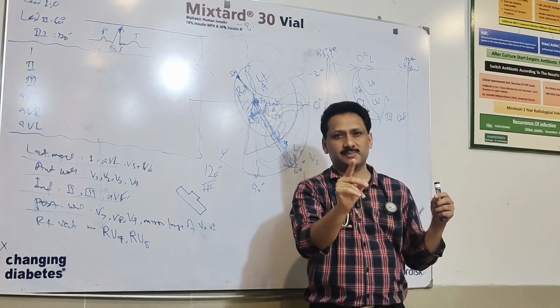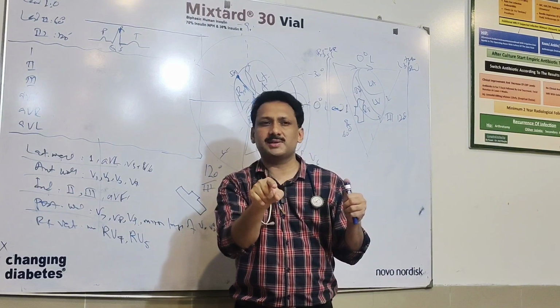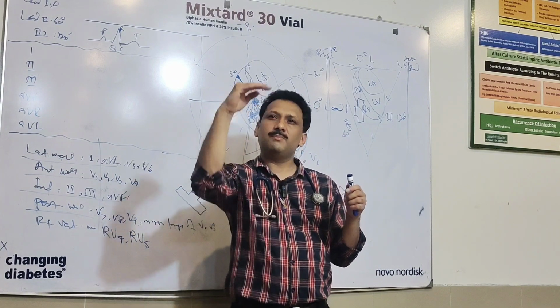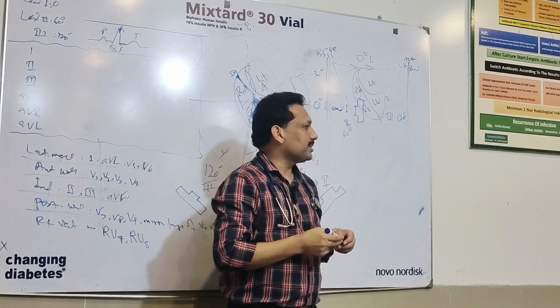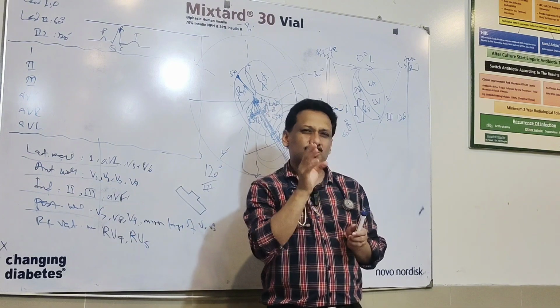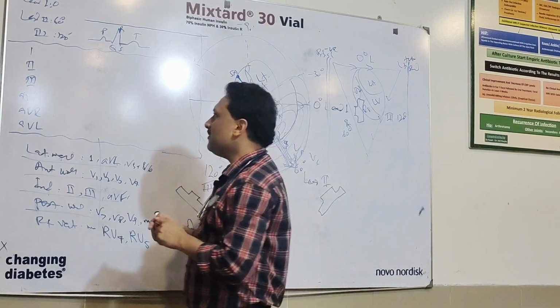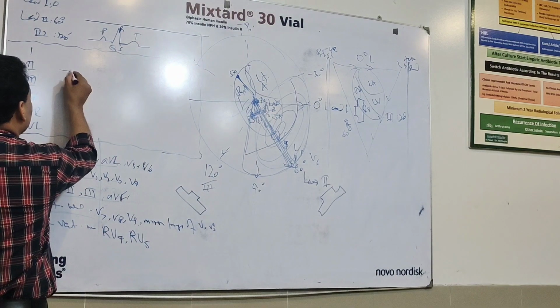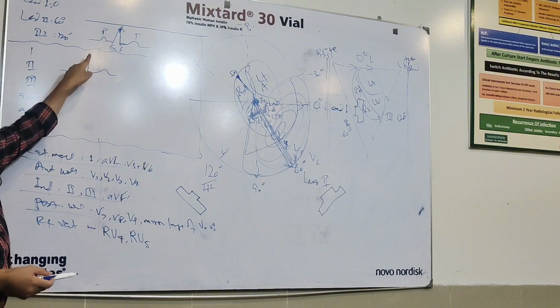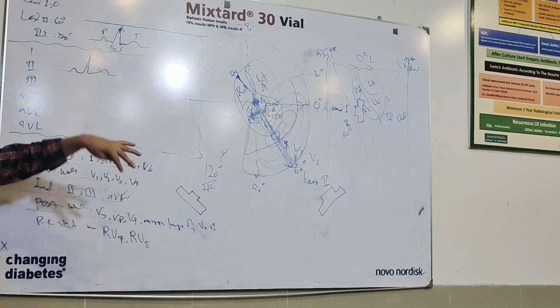Again, remember this sentence. If the direction of flow of current is towards the normal cardiac axis, the deflection produced by that stylus will all be positive. Now, if I ask you this question, out of these 6 limb leads, which limb lead is almost having direction exactly towards this cardiac axis? That is lead number 2. So if you see lead number 2, the deflection is like that. As simple as that. P wave above the baseline, QRS above the baseline, T wave above the baseline, all deflections positive.